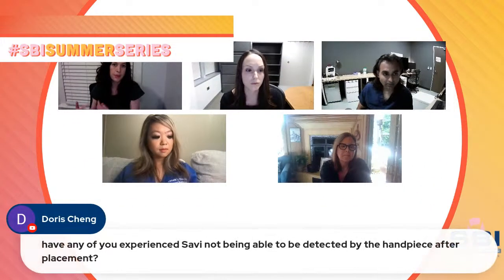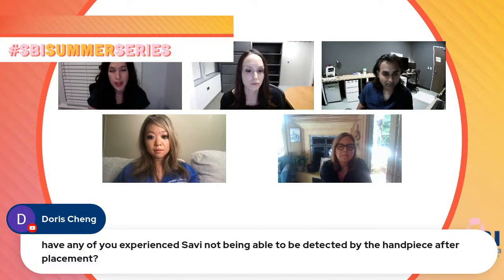So at my new institution, I'm doing primarily wires, again, based on familiarity of the surgeons. There was a trial of a different device, I think the Hologic tag, which left a large tract. And so I think the surgeons were having some trouble in the operating room with dislodgement, although that's just what I've heard, because I haven't actually placed many of those.